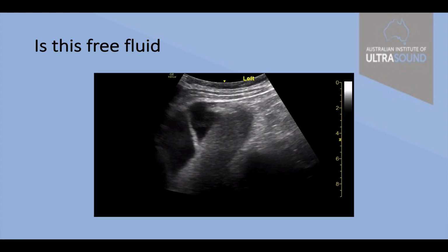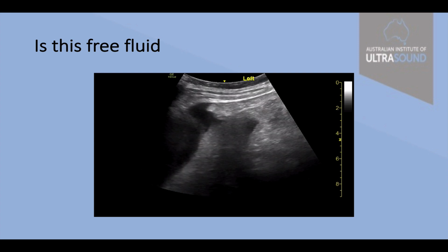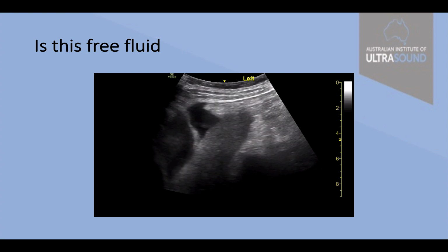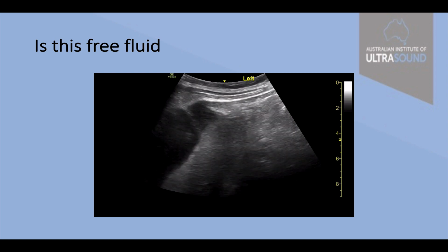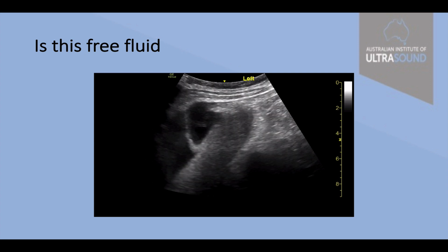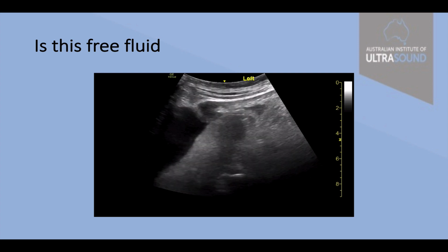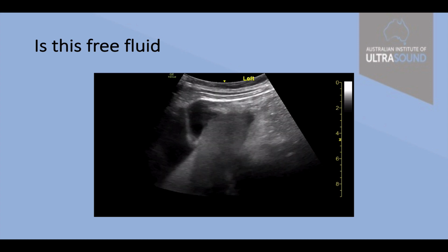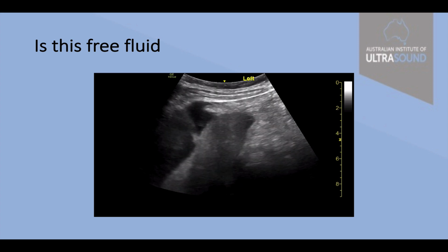Here's again an area of fluid above the spleen, and we have a fairly freely moving, waving tether between the spleen and the abdominal cavity, possibly a remnant of hematoma or fibrinous organization. Note how free fluid in the abdomen abuts the solid organs without any sort of bright edge or capsule. It's a very important thing to get used to, because fluid that's encapsulated often has a bright edge around it.